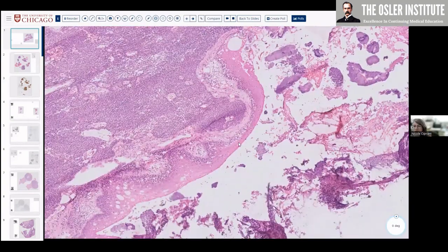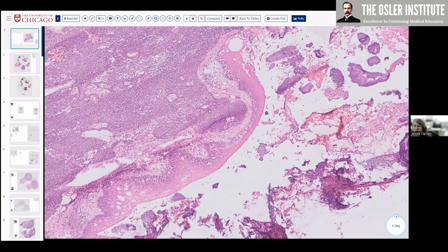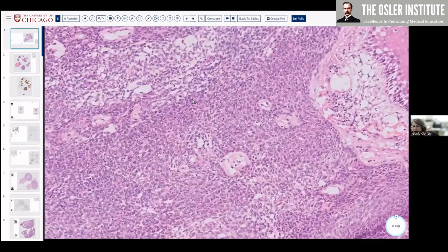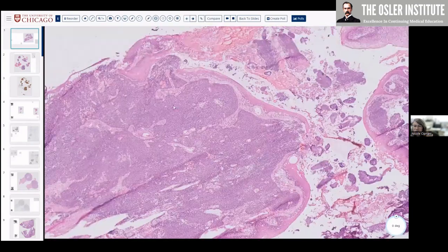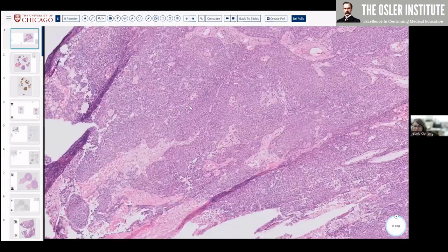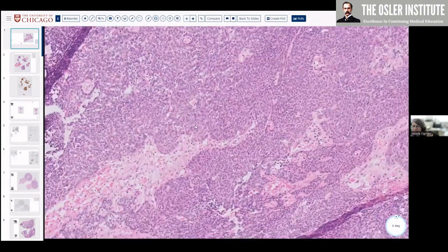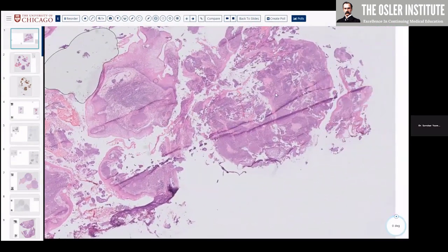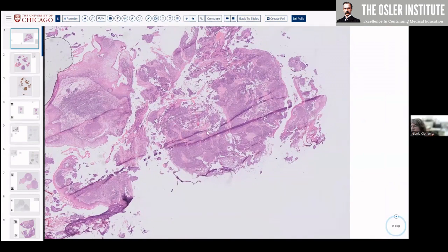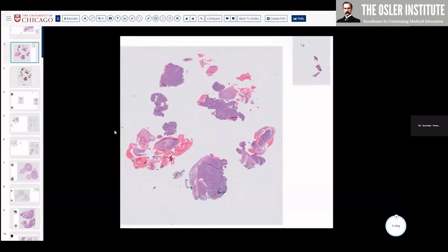All right, cool. So we have normal surface epithelium here with these very large solid sheet-like nests of tumor tissue. So, common things being common and uncommon things being uncommon, what is our first thought on what this is? SCC. Yeah, invasive or in situ, or we can't tell? Invasive. It looks invasive. Yeah, awesome.